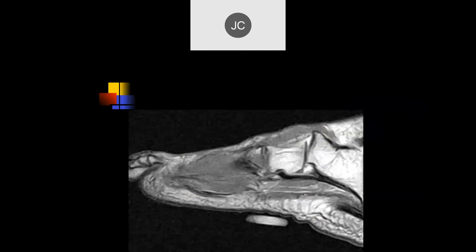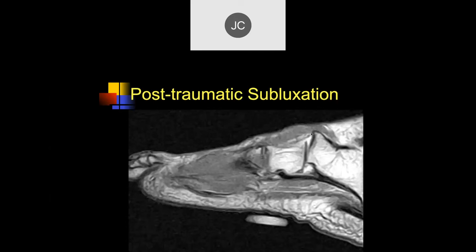Looking at this case — this is the distal calcaneus, and this is probably the cuboid. This patient has had prior surgeries and you can see there's a significant subluxation at this joint. One of the causes can be post-traumatic.